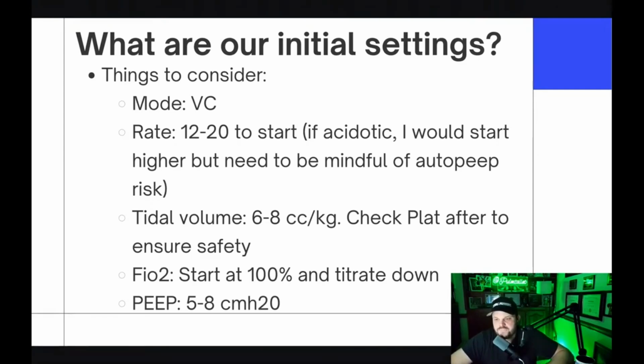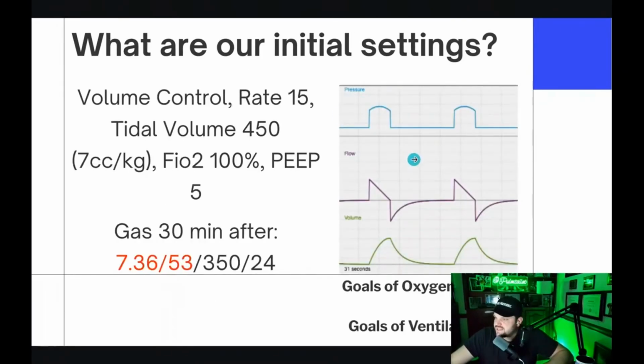And then, a PEEP. So start a PEEP somewhere between 5 and 8. I've worked at all kinds of different places, some start at 5, some start at 6, some start at 8. I usually start somewhere between 5 and 8. And then depending on what I need to do, I either go up or down on the PEEP. So this is not a vent.